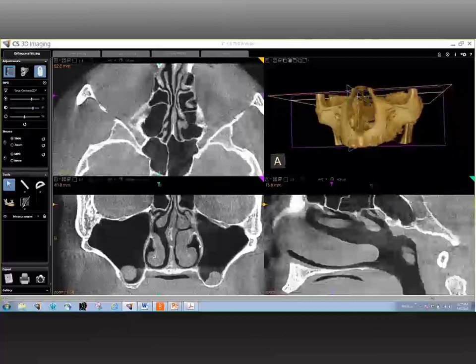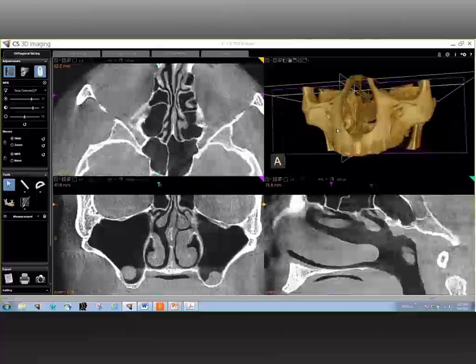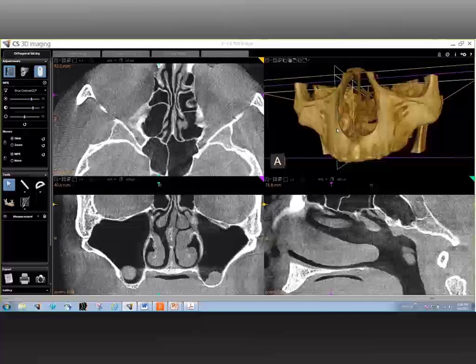For caries diagnosis, the traditional intraoral methods probably hold the best. Use your best receptor. Your bitewings, your regular periapicals, those are the modalities you need to rely on for now when it comes to diagnosing caries.